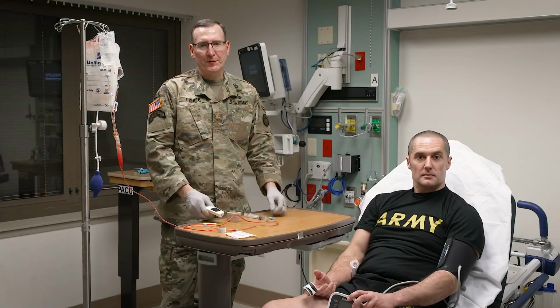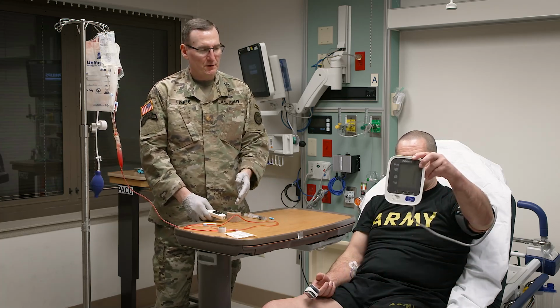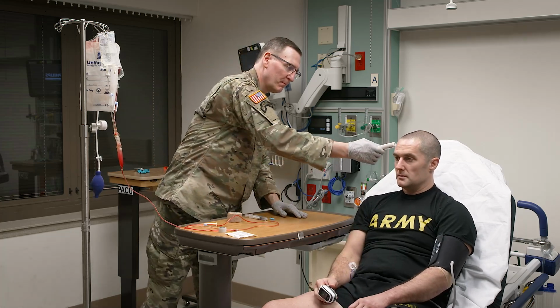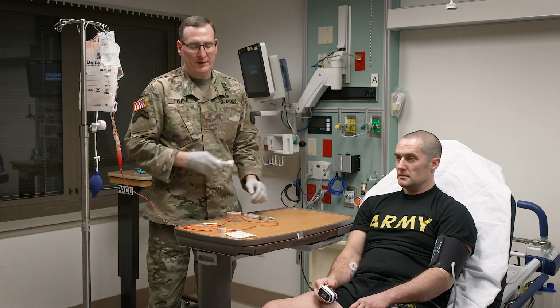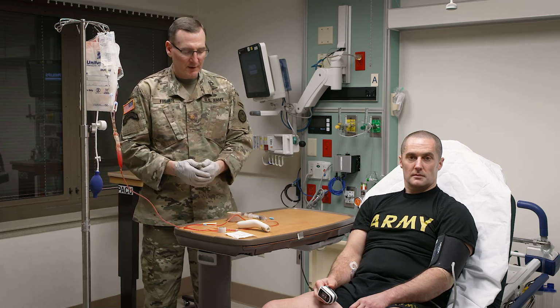All right, now that our transfusion is complete, we're going to do one last set of vital signs. Again, blood pressure, SpO2, heart rate, and temperature. Once that's complete, the transfusion process is complete.